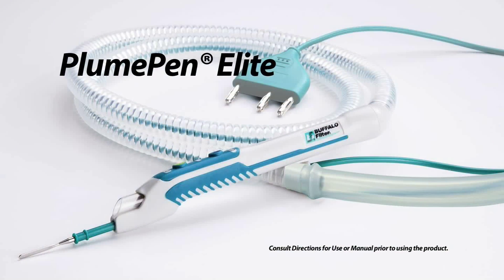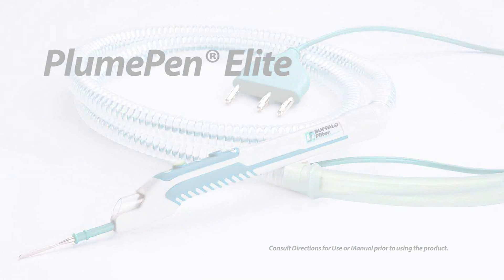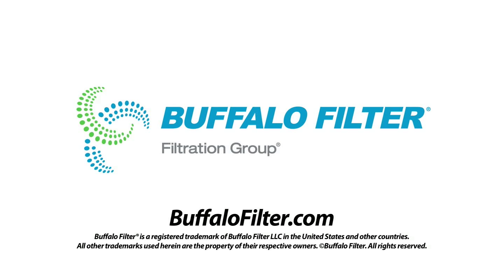Plume Pen Elite. Pushing the boundaries. Don't let surgical plume cloud your visibility. Contact Buffalo Filter to learn more about programs to help you go smoke-free.